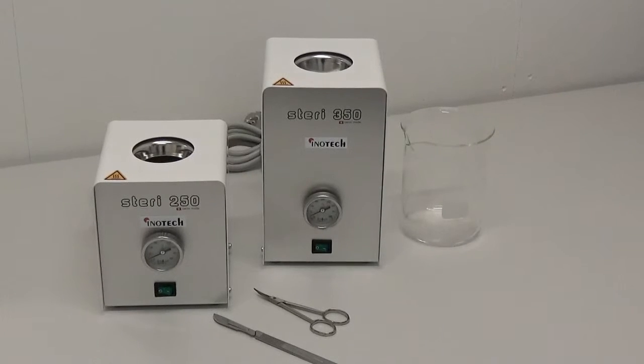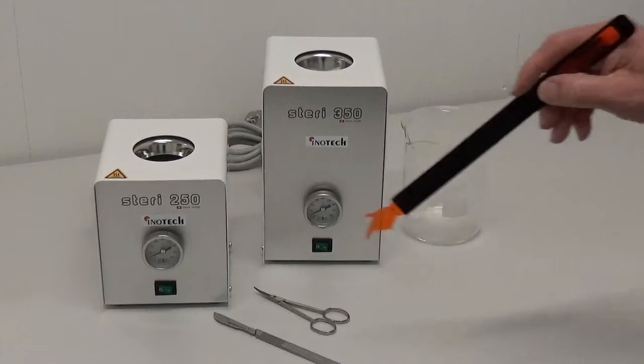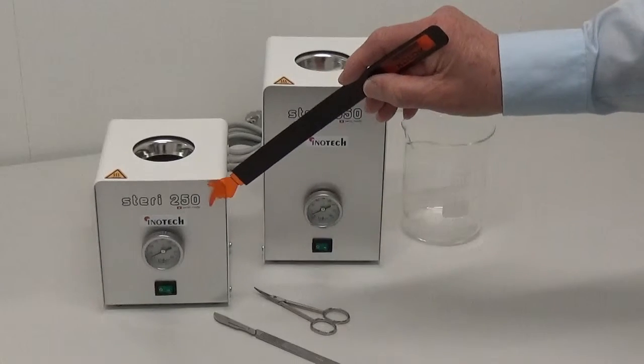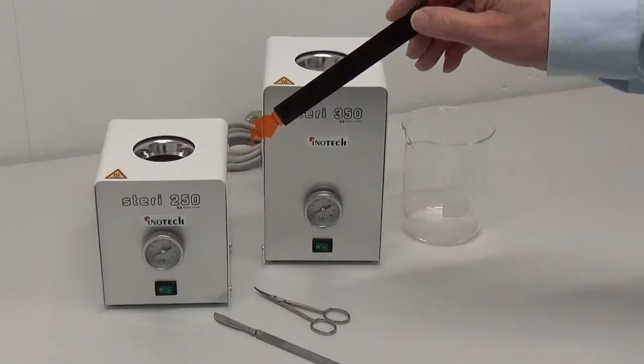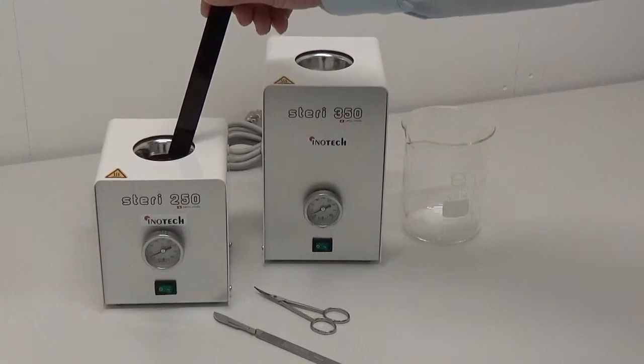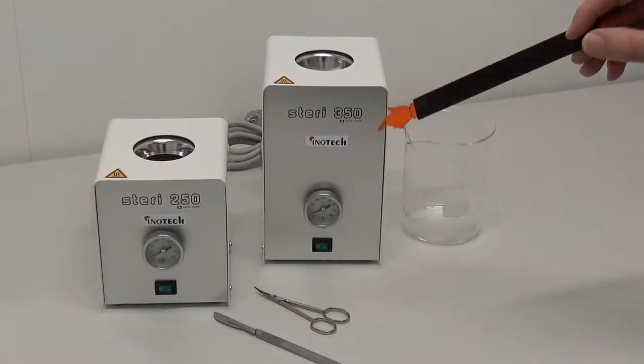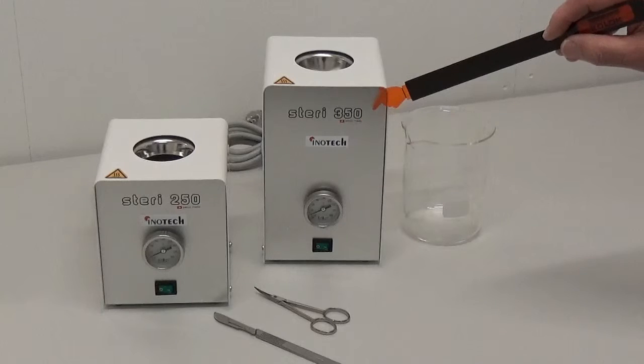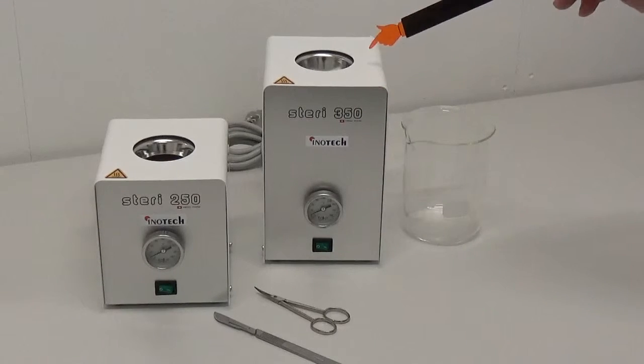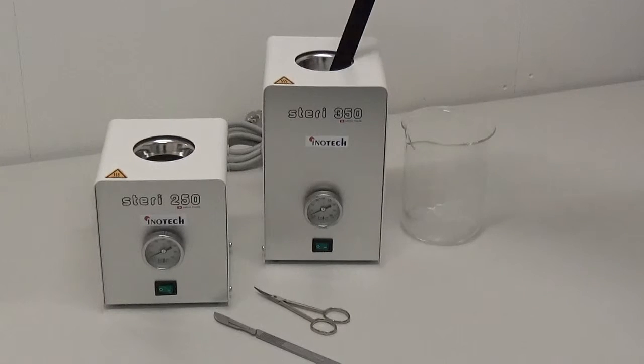Steris are available in two sizes. Steri 250 has a sterilizing well of 4 by 8 cm. Steri 350 has a sterilizing well of 4 by 14 cm.